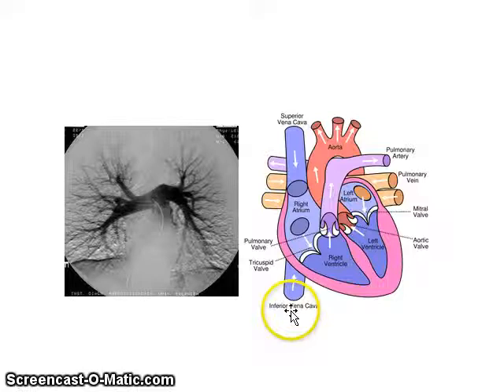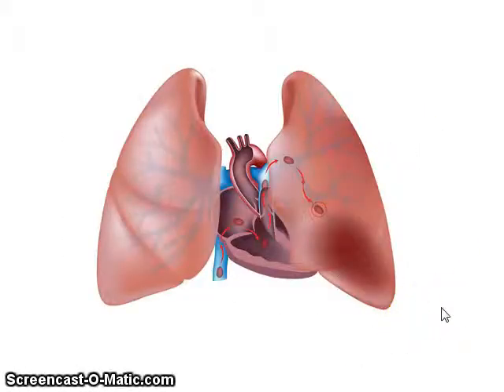The catheter is going up into the inferior vena cava, into the right atrium, right ventricle, pulmonary valve. So the catheter is sitting right about here in the pulmonary artery, injecting contrast, and then contrast is going out the pulmonary arteries, both the right and left side. So the main reason a pulmonary arteriogram would be done is to look for a pulmonary embolism.